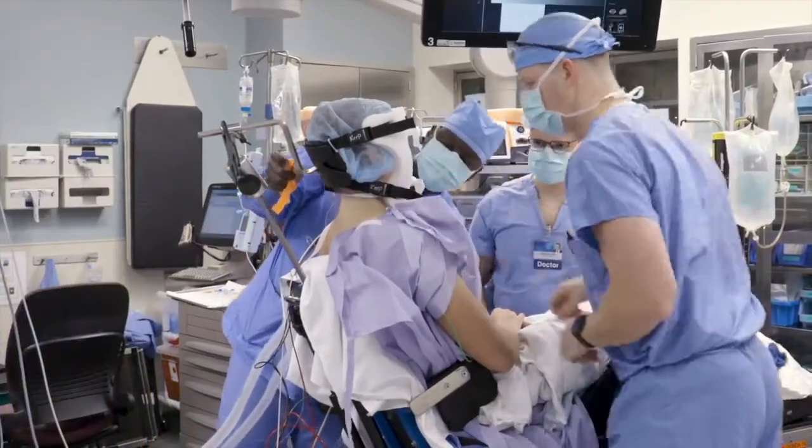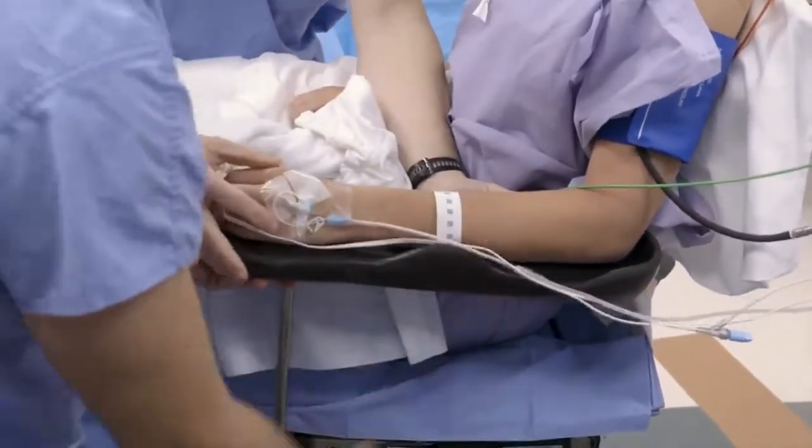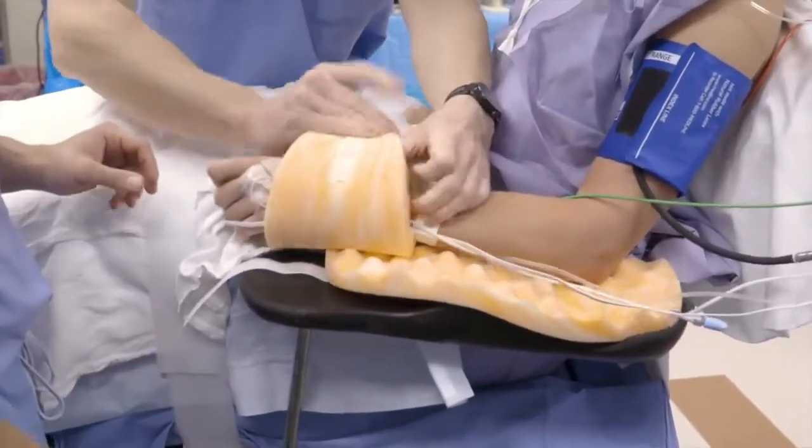On the opposite side, we place an arm rest which is brought up so that the elbow is placed at no more than 90 degrees of flexion and in a neutral position. We then make sure that the forearm and the wrist bony prominences are well padded.